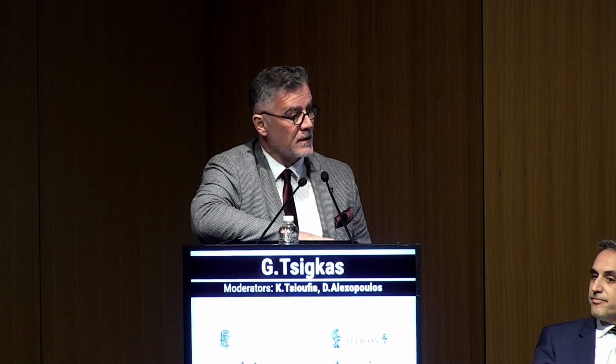Now, if other vessels have been stented, I agree with Professor Angouras here that we probably continue dealing the same hand. But if the previous vessels had not been stented, then we would be really hard-pressed with this patient. Okay, Grigori, what do you think? Gregory, in theory, you are right, but again, based on the technology of current stents, with the open cell technology, it is not very common to lose, at least you could say, great branches.